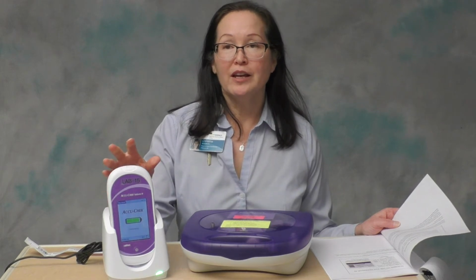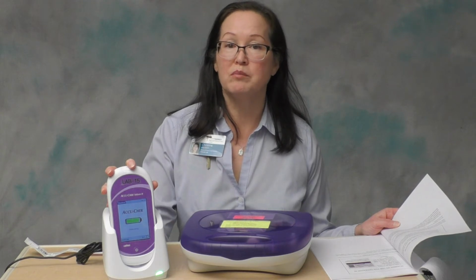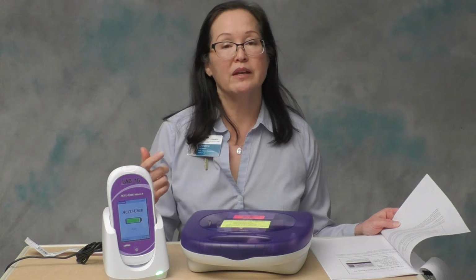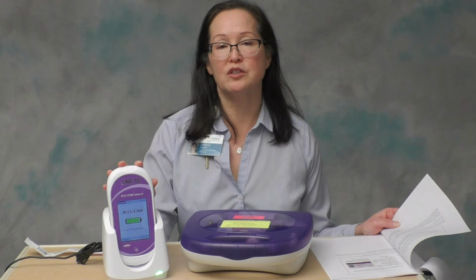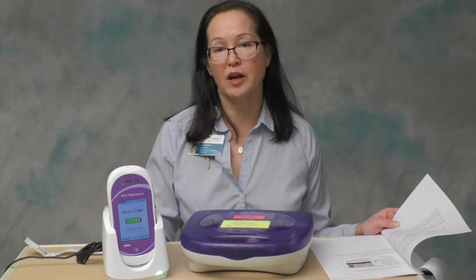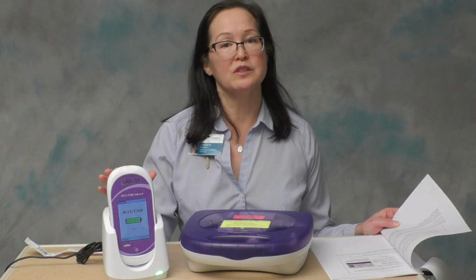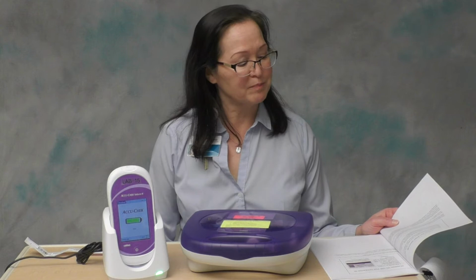And it's not an immediate process. Once you run the QC, it actually can take up to 30 minutes. You have to download the meter into the base. It uploads that information into our software and then sends it back down, the recertification down to the meters, and that takes some time. So please, the first time that you see that message pop up, just run the QC. That way you'll be ready to use the meter when you need to use it.